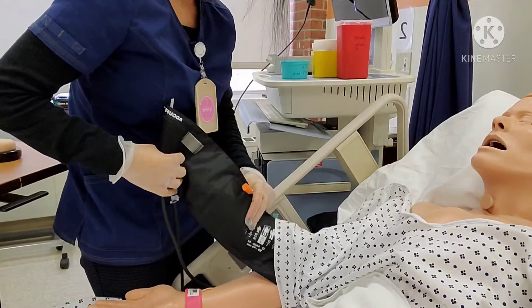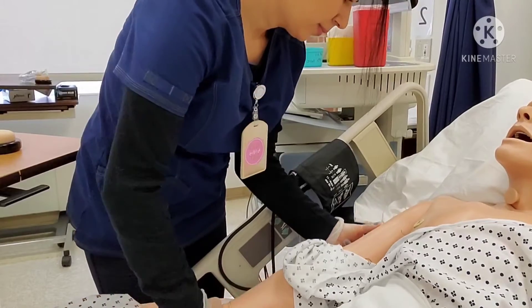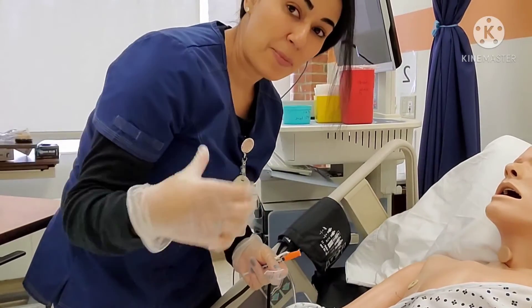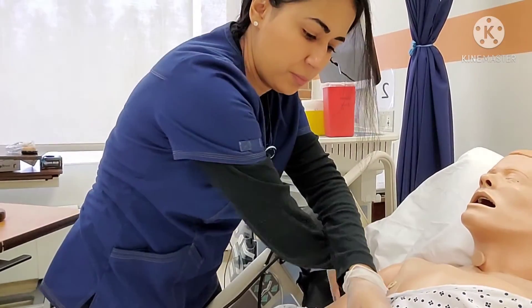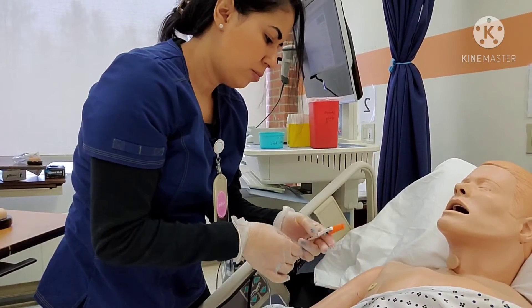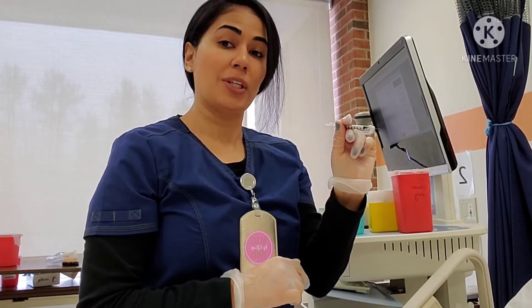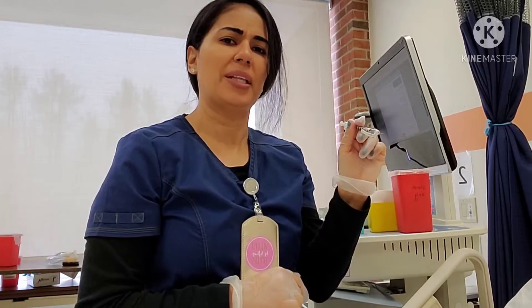I'm going to push my patient's gown down and remove the blood pressure cuff, having the patient relax their arm. I have my alcohol and my gauze. I want the fatty part of the back of the arm, so I'm going to grab and clean it with my alcohol. While it dries, I'll get my gauze ready. Sometimes you don't really need a gauze, but I brought it just in case. I'm going to take off my cap. When administering the sub-Q injection, you want to hold the syringe as if holding a dart and dart it in — not forcefully, not painfully — so you make sure you hit that adipose tissue.